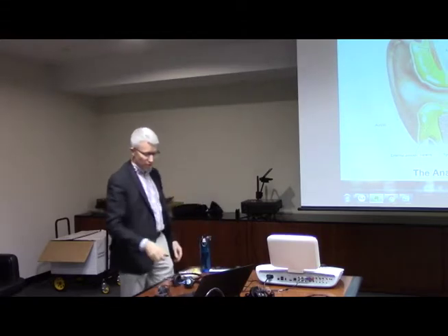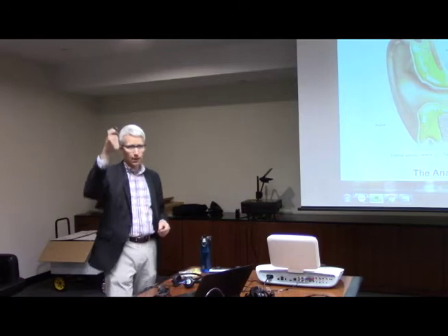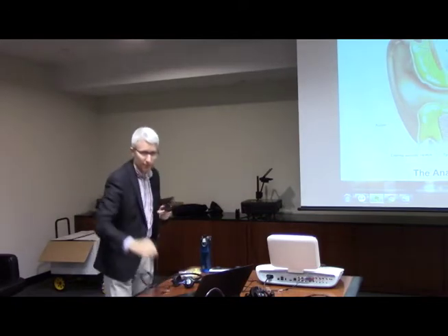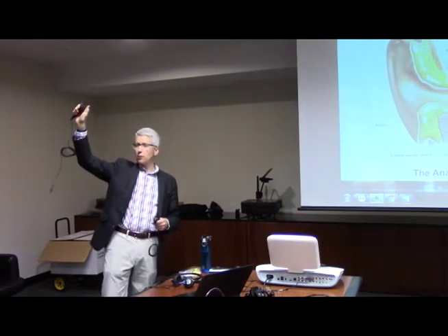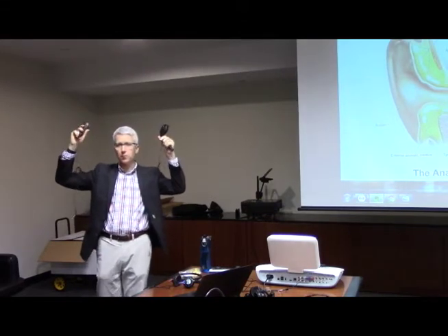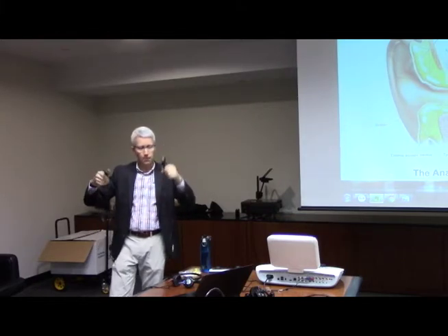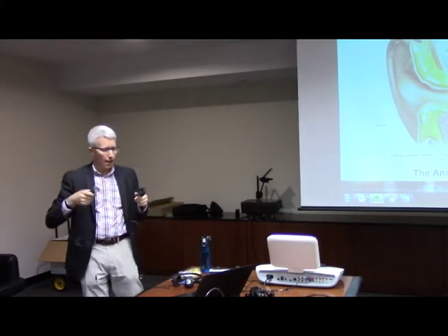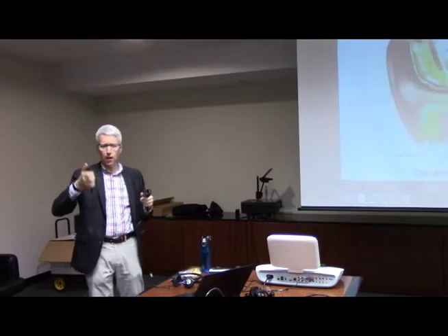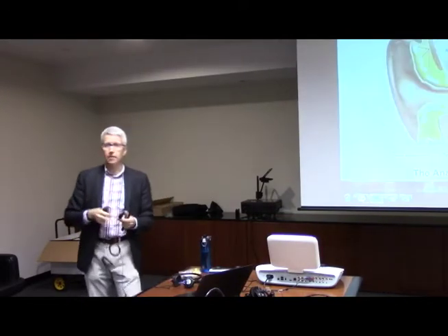And what's happening when we do this is the patient has a response button in their hand, something like this, and every time they hear the tone, they push the button. So these are two of the response buttons. We have some that we make here. Each manufacturer has their own. This is GSI, this is Interacoustics. I think Mako uses this one as well. But this is just a way for the patient to respond and say, yeah, I hear it.